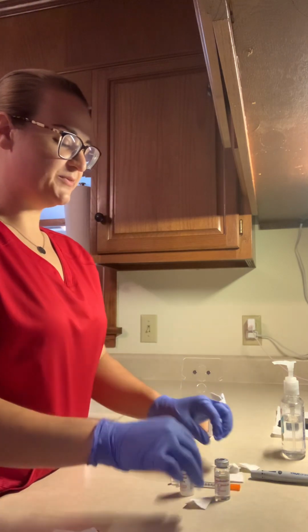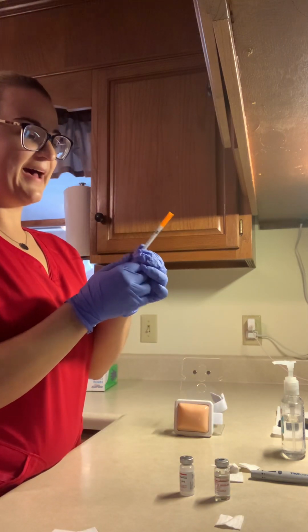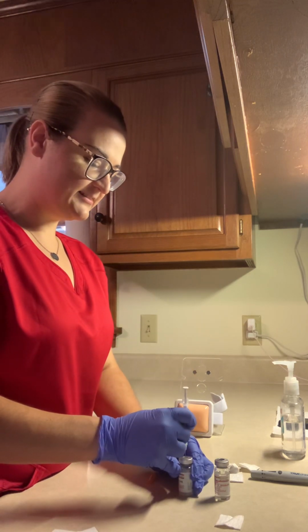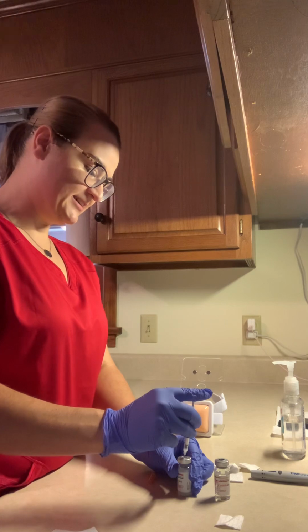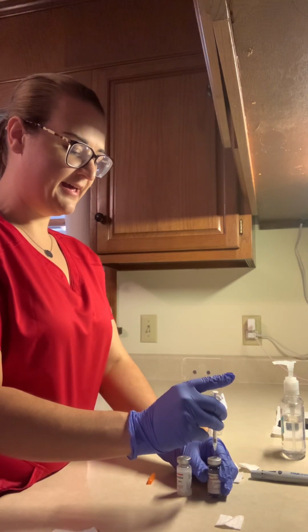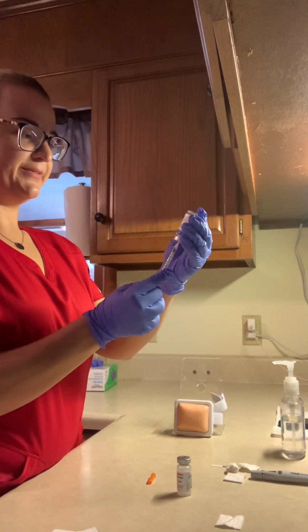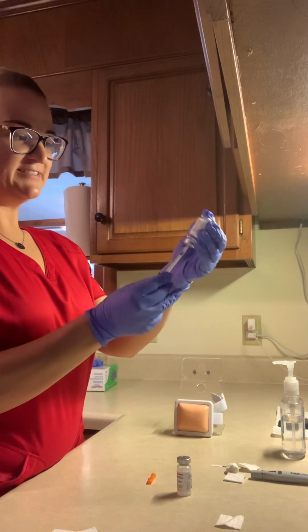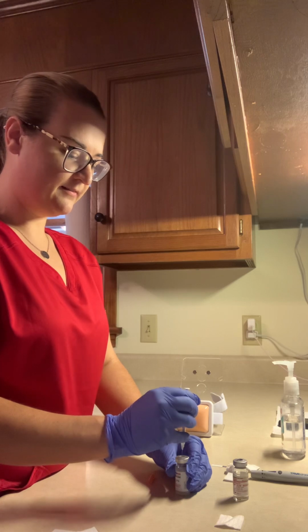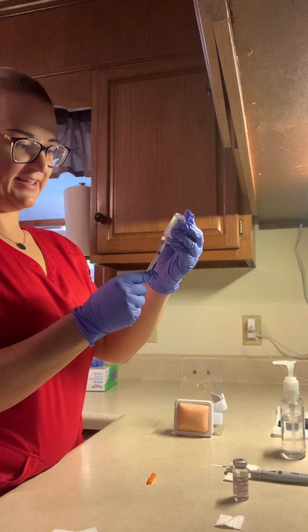of the vials with a rubbing alcohol pad and pull back 10 units of air, inject 5 units, being sure not to touch any solution in the NPH, and then 5 units in the regular. Pulling back 5 units of the regular and 5 units of the NPH.